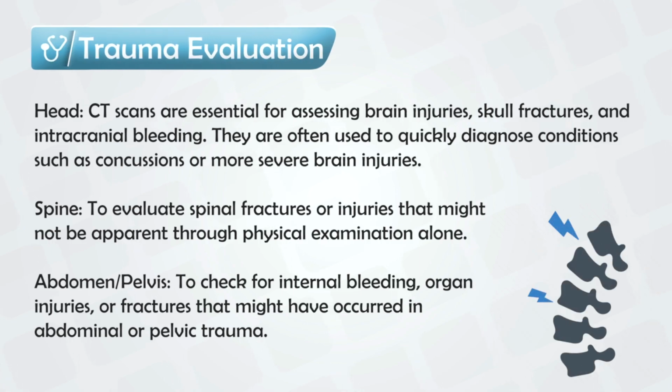For trauma cases, CT is especially useful, as it can visualize the brain and early signs of internal bleeding. So in cases where there is severe trauma in the patient, but you don't find a lot of results in the examination, the CT can be used to visualize the internal bleeding processes and also the alignment of the bones. So even if there is some mild internal bleeding that you did not find in the examination, or there is a mild fracture in the spine or the skull, they can be diagnosed very early using CT.